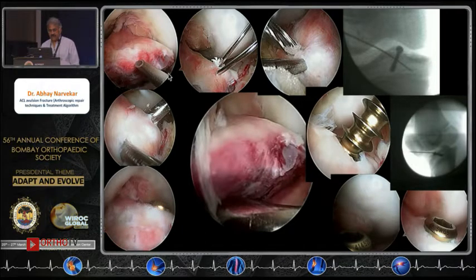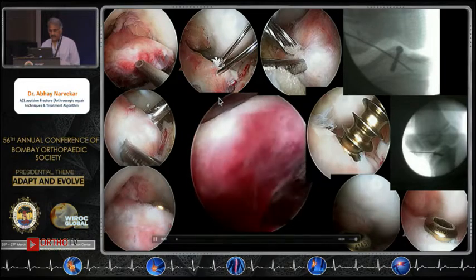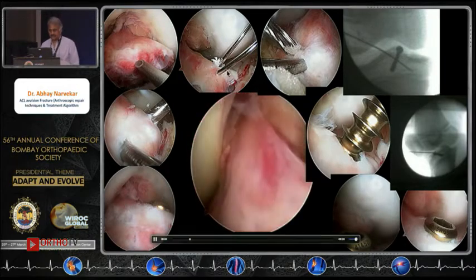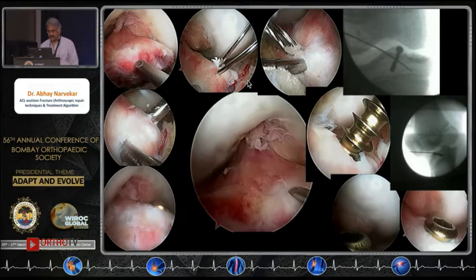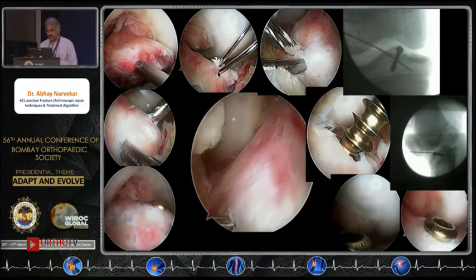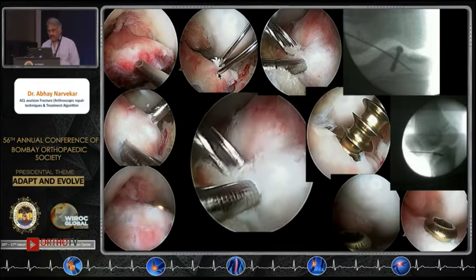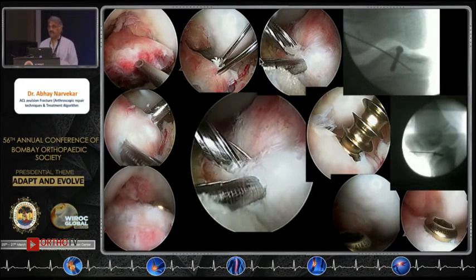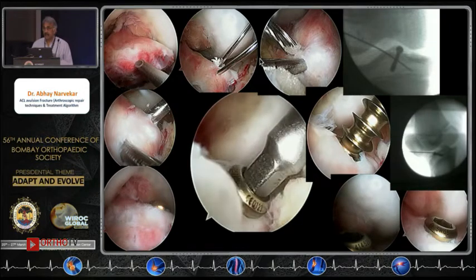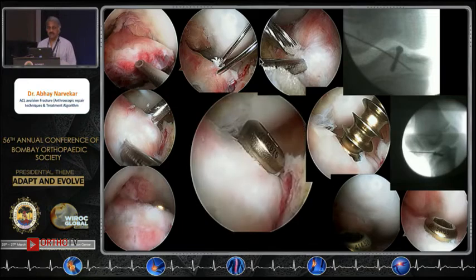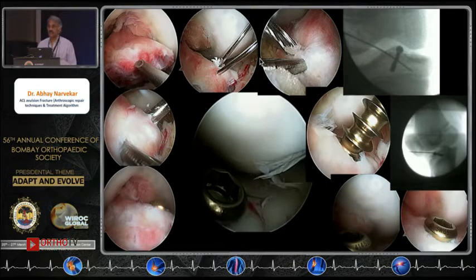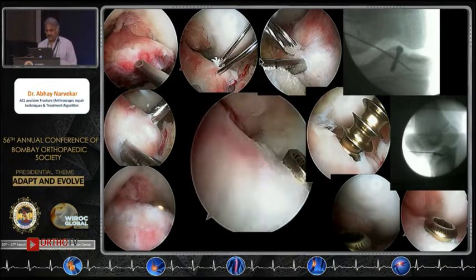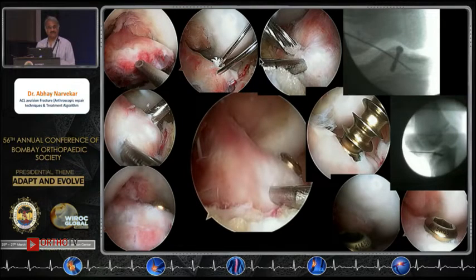The first step is to clean up the area and then do a temporary fixation. Remove the intermeniscal ligament, as it prevents reduction, then place a pin transpatellar for temporary fixation. Remember that most anterior fibers of the ACL are continuous with the anterior horn of the lateral meniscus, so this fracture tends to hinge onto the lateral side. Therefore, fix it on the medial side first.